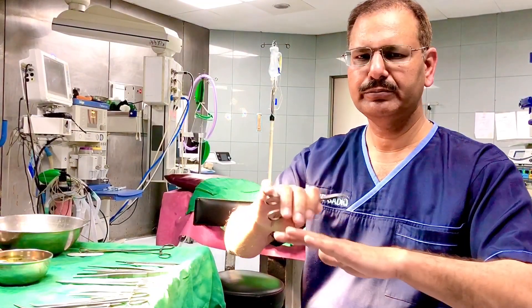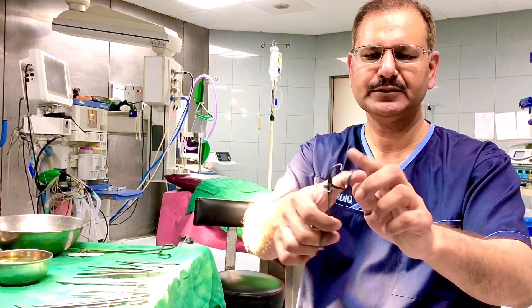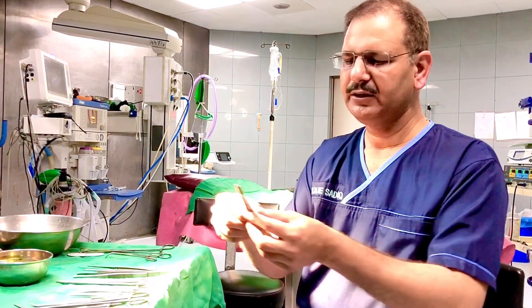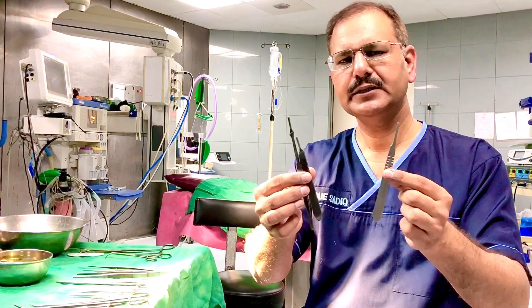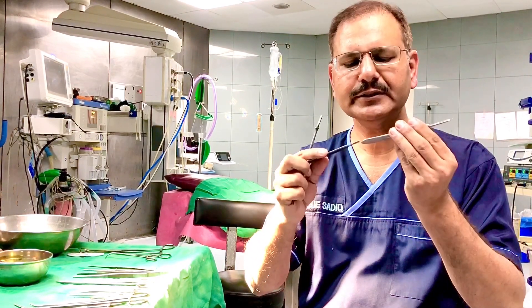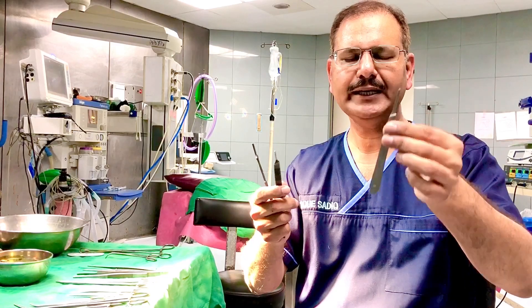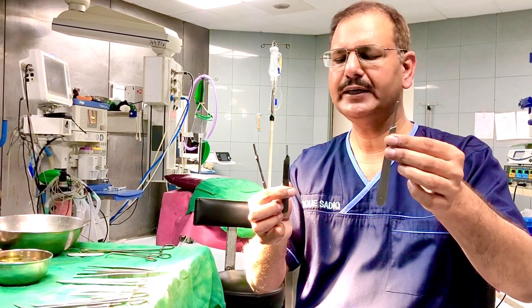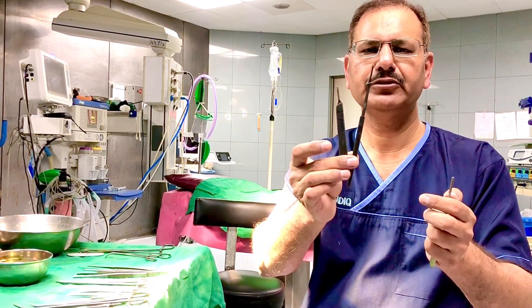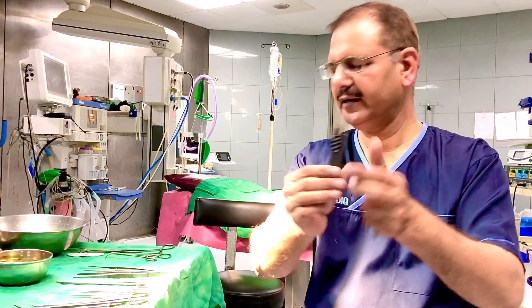After scrubbing, you cover the patient with drapes, and drapes are fixed with towel clamps — these have sharp edges to hold the towel. Then you make an incision using different types of handles called BP handles (Bard-Parker handles), which come in different sizes. Handle number four is used to fix blades of size 20 and above; blade sizes 11, 15, and smaller are fixed on handle number three.